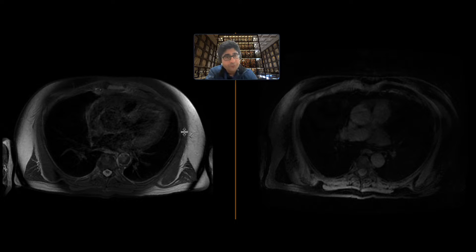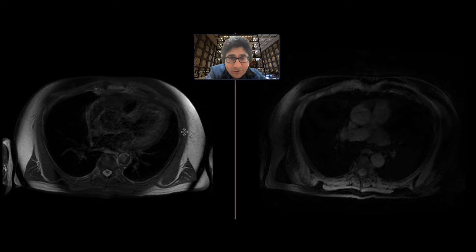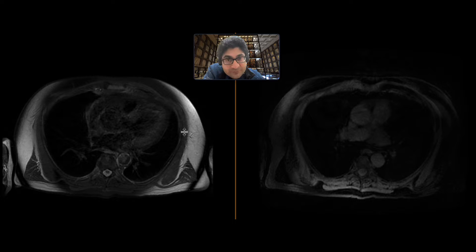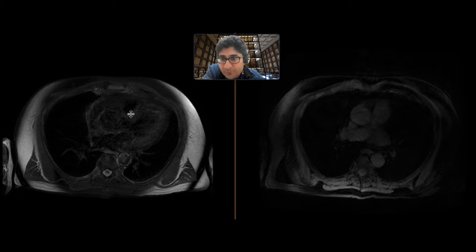This is a patient who had some biochemical abnormality that prompted CT imaging. They saw a mass in the abdomen and subsequently got an MRI. I'm going to show you a few sequences from the MRI.